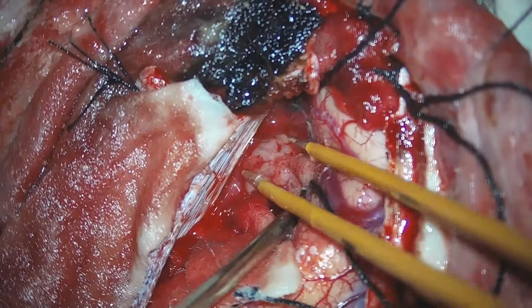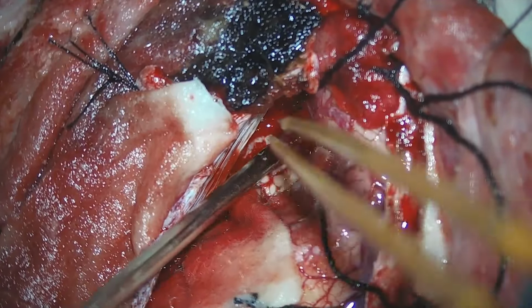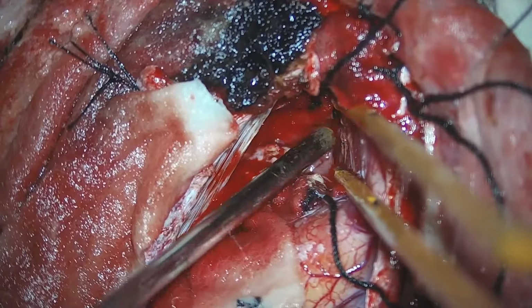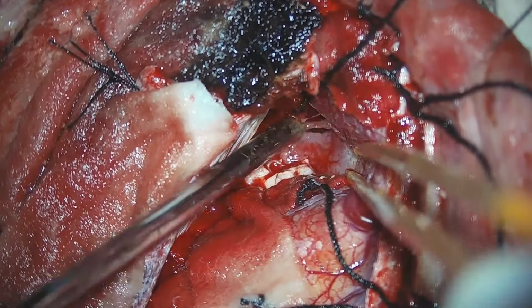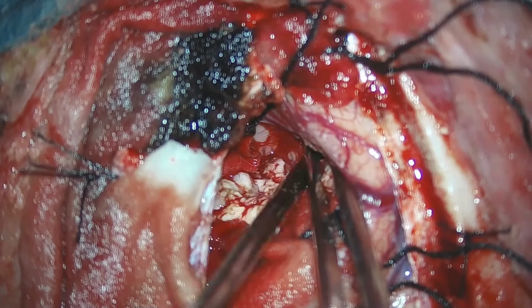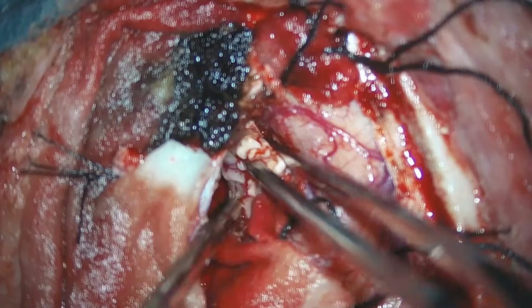Here we can see one cortical vein that is lying just over the tumor, which is carefully retracted without damaging it. Now, after retraction of the normal brain, we are concentrating more on the lateral aspect of the tumor, where we are trying to find a space between the tumor and the normal brain.